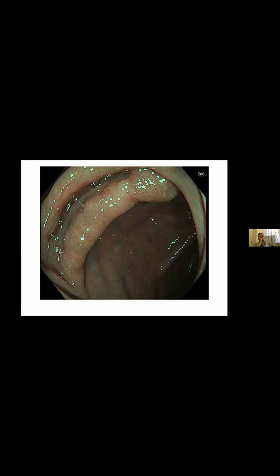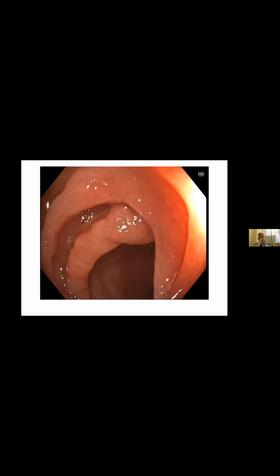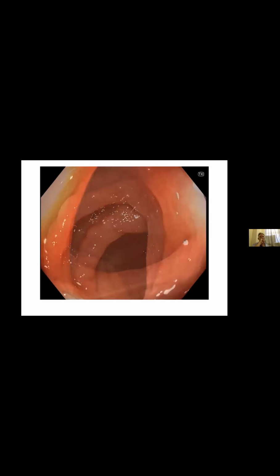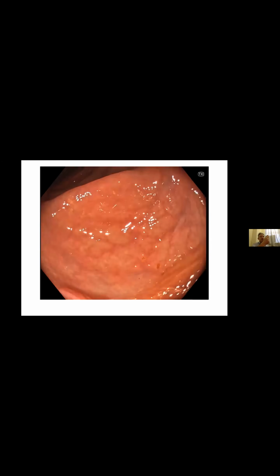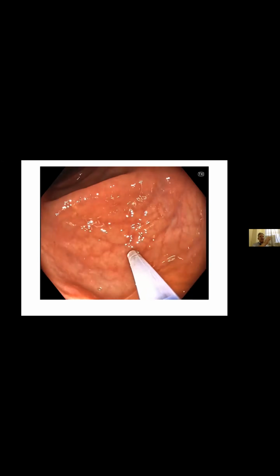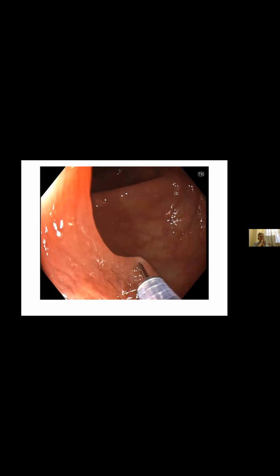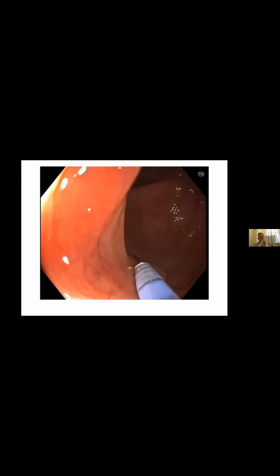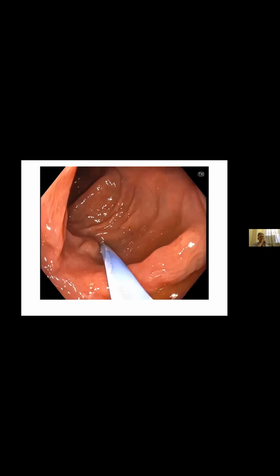I would imagine it's got low-grade dysplasia only. Not a particularly worrying polyp. It's probably about 8 millimeters. I've now twisted the scope around. This is the same polyp, believe it or not. Where you want to keep the polyp is around about 5 o'clock, because that's where your channel comes out. It's much easier to work lower down, although we struggled quite a lot trying to do this.